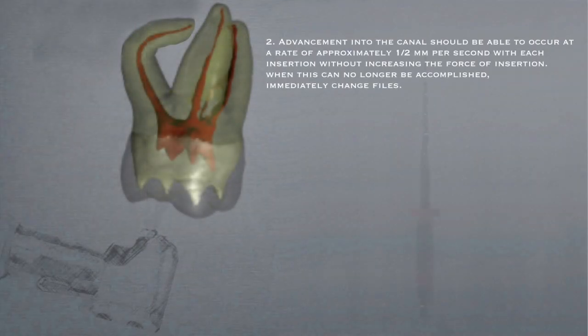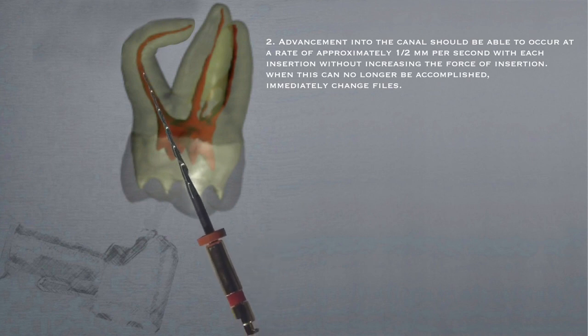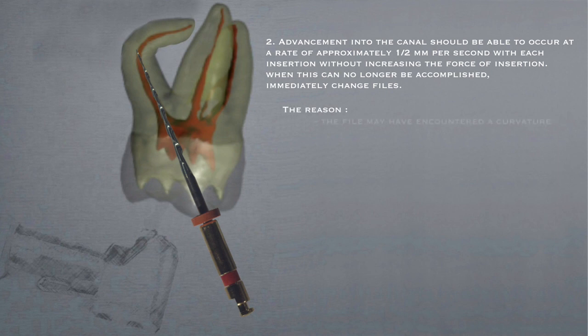Advancement into the canal should be able to occur at a rate of approximately 1/2 mm per second with each insertion without increasing the force of insertion. When this can no longer be accomplished, immediately change files. The reason? The file may have encountered a curvature.